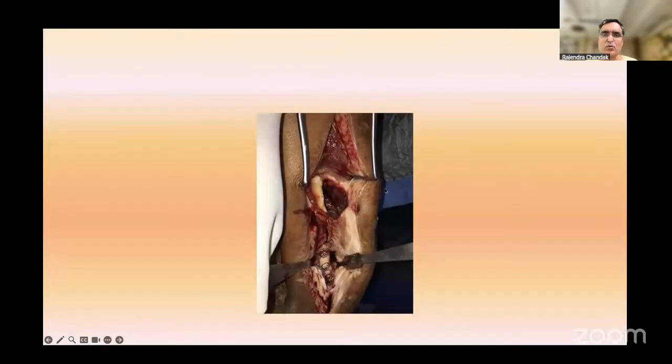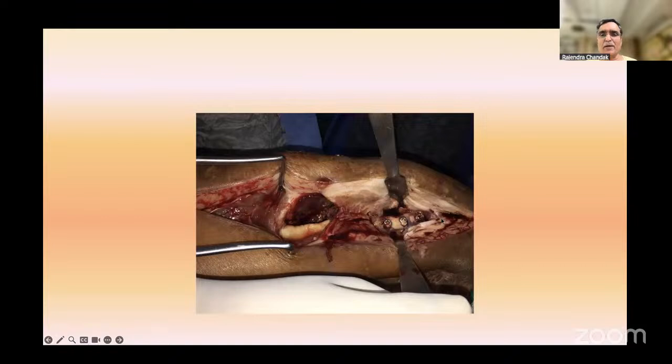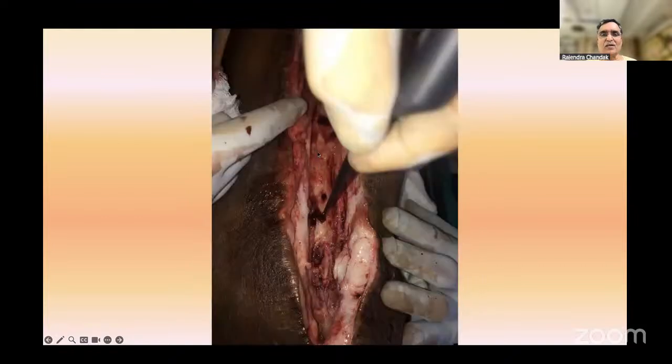And once that is controlled, so this is how initially, at the time of bone necrosis and everything, the screws we remove them, debride thoroughly. The whole tissues are debrided completely. This has to be completely cured.